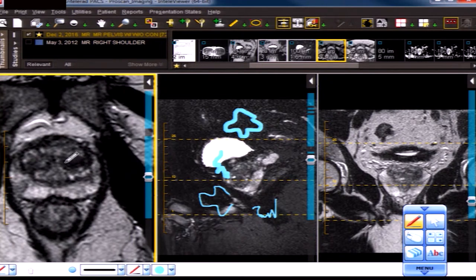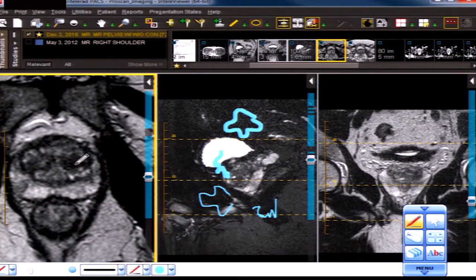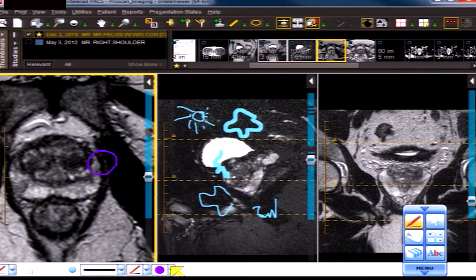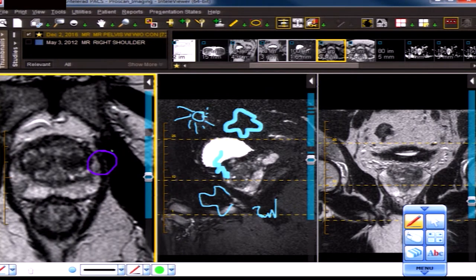For margins: a well-circumscribed margin is distinct and easy to see. A blurred or indistinct margin is harder to tell where a lesion starts or stops. Obscured means not clearly seen or easily distinguished. Irregular margins are uneven, jagged, or serrated. Spiculated margins radiate lines extending from the center of an area — like a breast carcinoma. Encapsulated means bound by a complete rim of a slightly different, usually darker, shade — as seen with BPH nodules, even extruded ones.